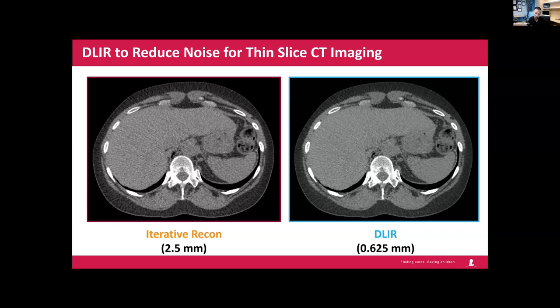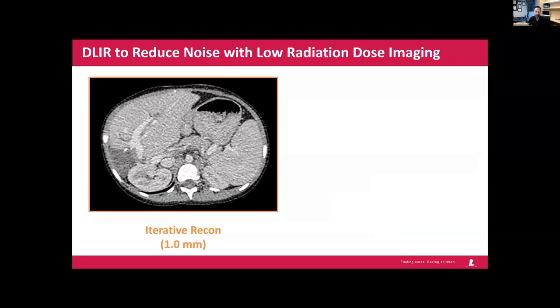And by the way, these algorithms sometimes are specific to a certain type of window. So for example, it'll work on soft tissues. Now I can change the window settings and still look at the bones and the lungs, but it's not that type of a kernel that can be used. And in this particular vendor, I can't do a bone kernel or a sharp kernel and then apply this algorithm. Those things will come with time. I'm just telling you right now, it tends to be a bit body dominant for a typical smooth algorithm that would be used for body imaging.